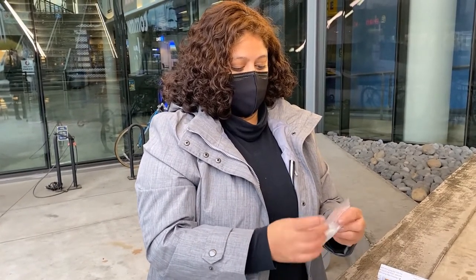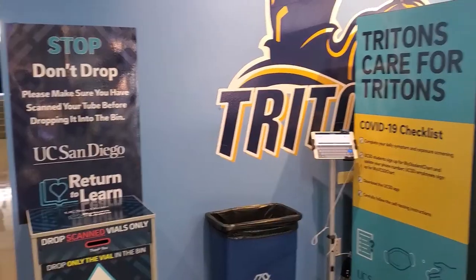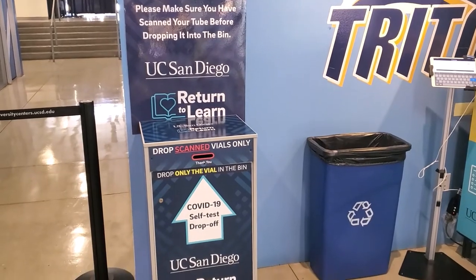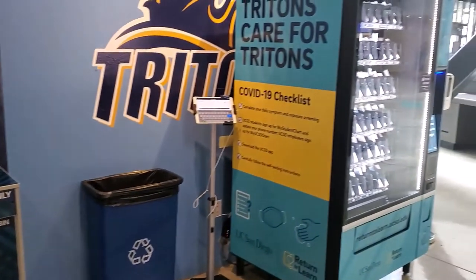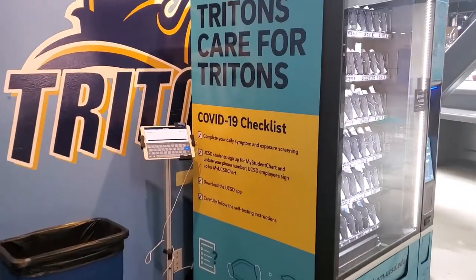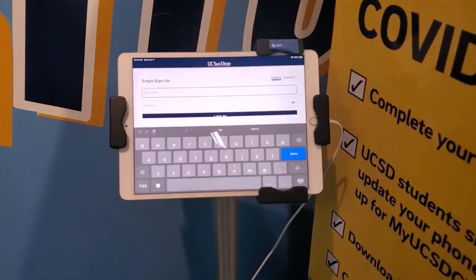Now I'm ready to walk back inside the Price Center and drop it off. The last step is to drop off only the vial in one of the drop-off locations. I use a drop-off location that's right next to the vending machine. As an additional tip, if you forget your phone or your phone's not working properly, you can use an iPad located next to the vending machine to scan your tube.